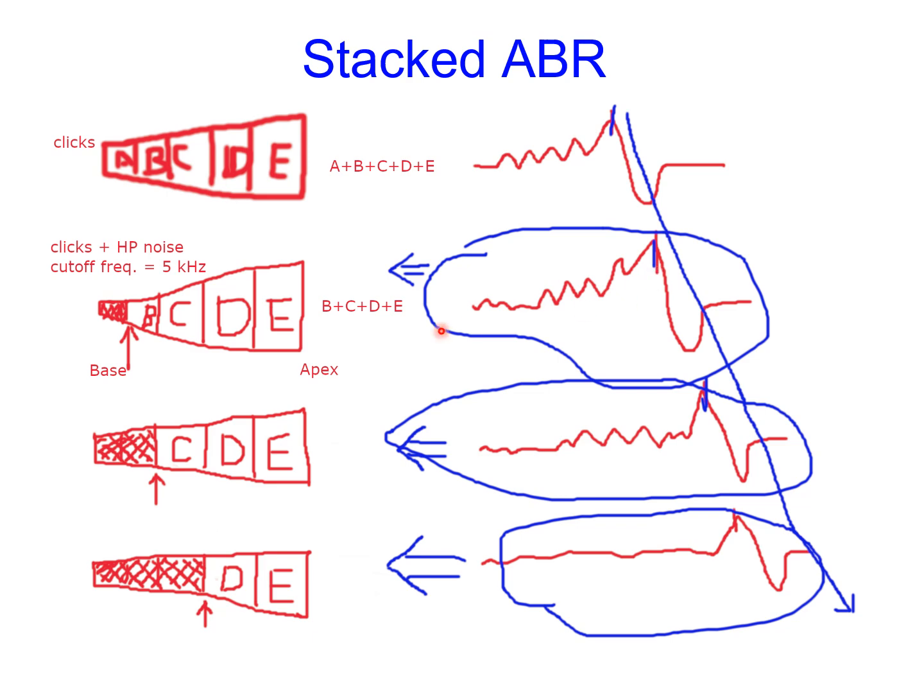For the second recording, because the high-frequency A segments are excluded, the latency will be dominated by the portion more toward the apical end. The basilar membrane toward the apical end is wider, softer, and floppier, so it results in a longer latency for the ABR waveform. As you can see, the wave 5 latency here is a bit longer than in the first condition.